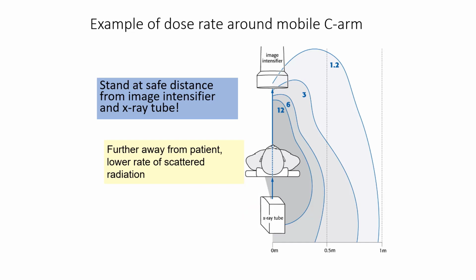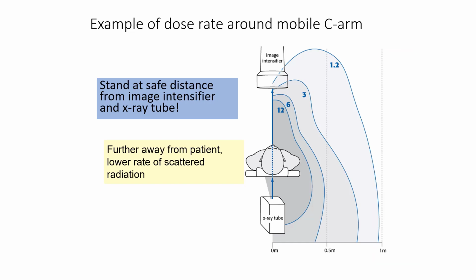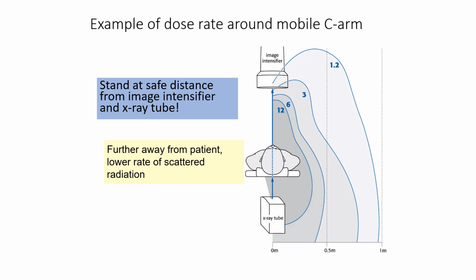If you're standing approximately 1 meter away from the dose that goes into the patient, what you get is 1/1000th the actual dose that we're using on the patient at that time. The idea being that the radiation goes into the patient, it is then scattered from the patient, and by distance we're getting 1/1000th the dose if we're a meter away, and we're wearing, in addition to that, protective equipment, lead vests, thyroid shields, and eye shields, which blocks 99% of the radiation that may actually get to us.